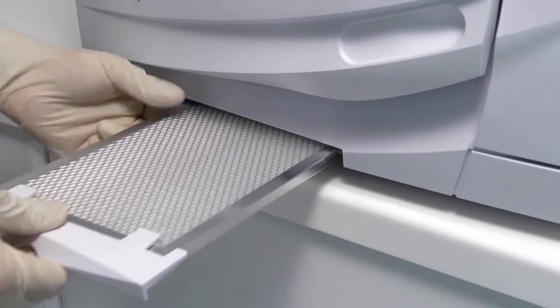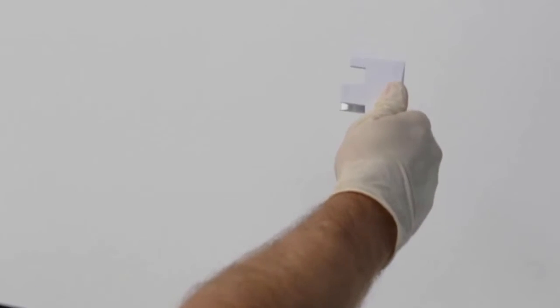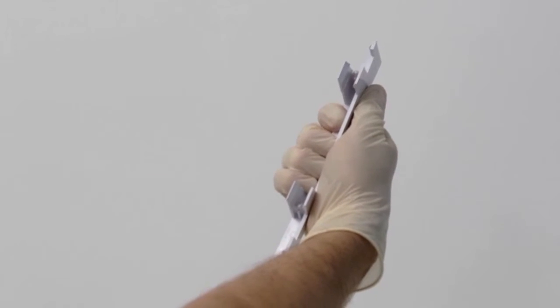To change your filter, simply pull the filter directly towards you by the handle until it has been fully removed. The old dust filter can be removed from the handle by gently pulling the retaining clips apart.